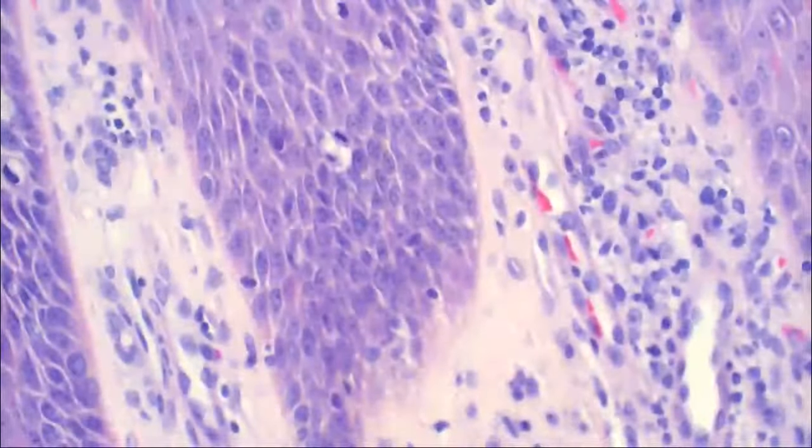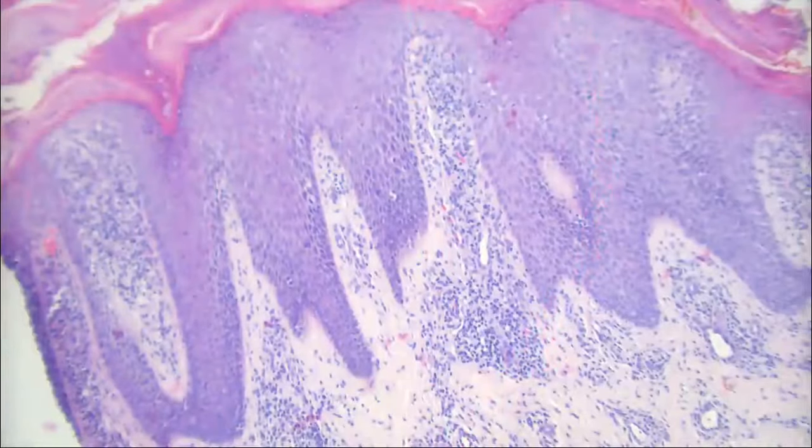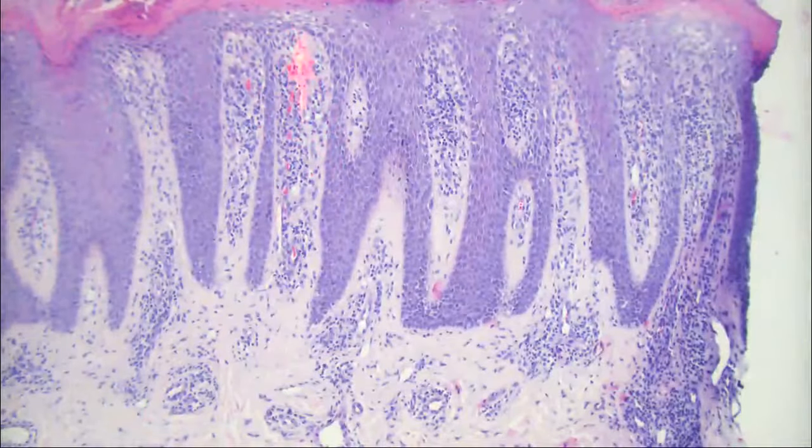So normally it takes about 6 weeks to go from the basal cell layer all the way to be sloughed off here. In psoriasis, that's just a few days, much faster. So that's why we use things to slow down that mitotic rate. So good, this is a classic example of psoriasis. You can sometimes get some spongiosis in here. You get a lot of inflammation in psoriasis. Sometimes you can get some eosinophils in psoriasis.